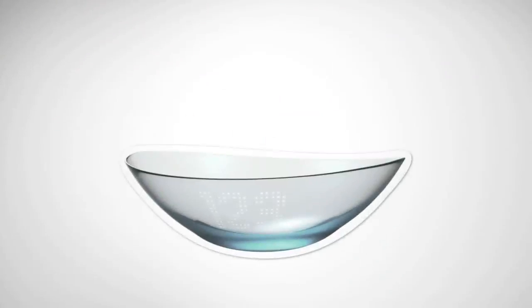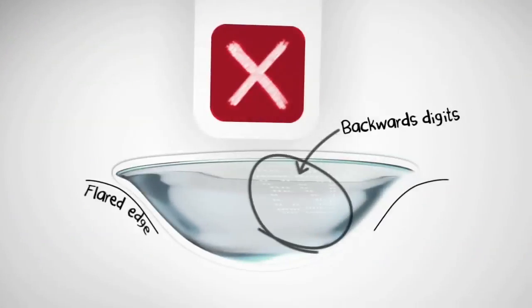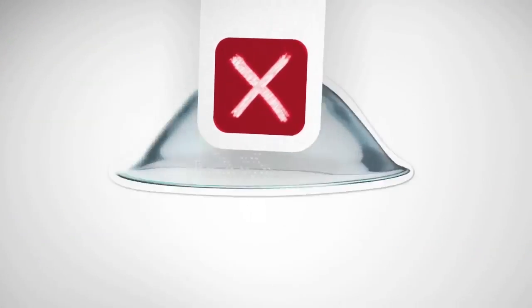Once your AccuVue lens is on your fingertip, you've got ways to make sure they're right side out. The shape, and for most of our lenses, the 1-2-3 along the edge. Backwards digits or flared edge, flip it over.